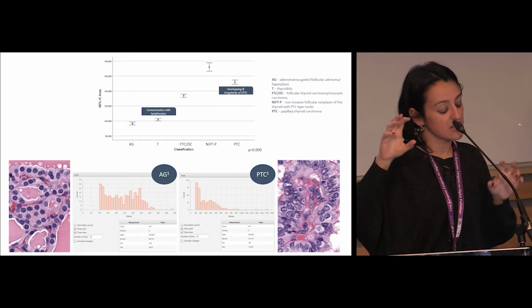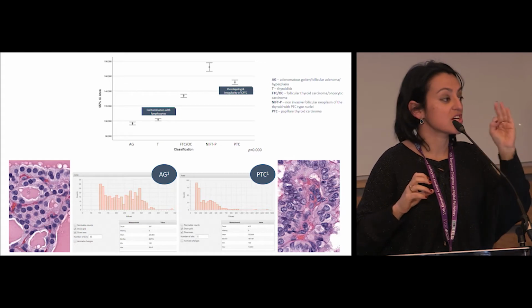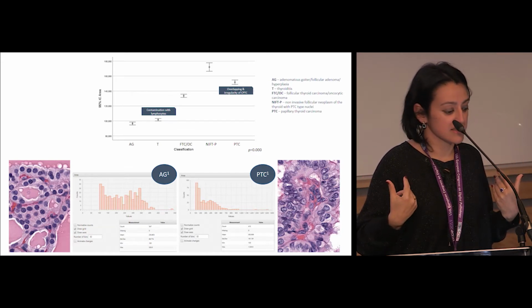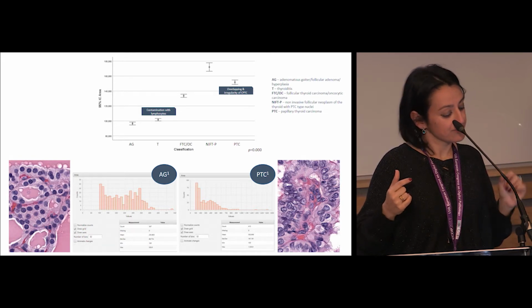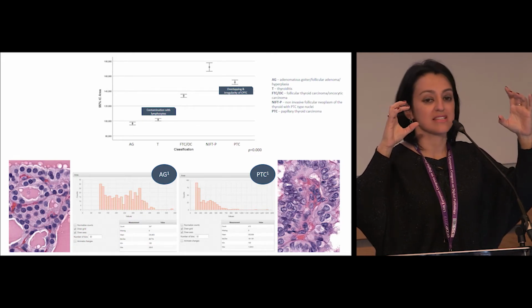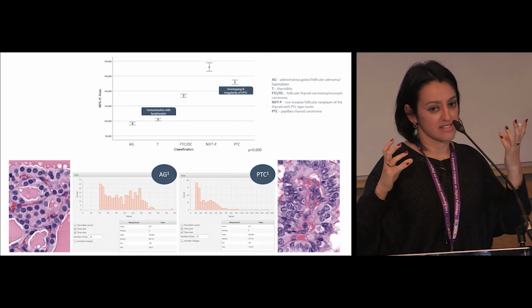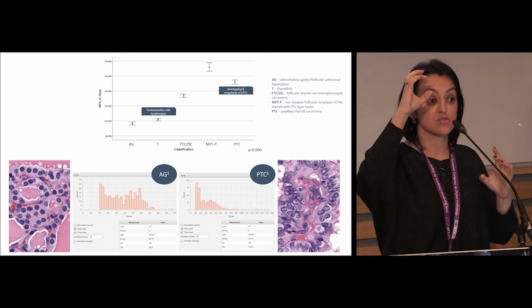I think here, we had problems in separating epithelial cells from lymphocytes, which are smaller, and that decreased the mean area of the nuclei that we identified in these lesions. Then we had another problem here. NIFT-Ps and PTCs, by concept, have more or less the same type of nuclei. And we realized here that those in the NIFT-P appear to be larger in this analysis. And it doesn't make sense. Either they are similar, or they are smaller.